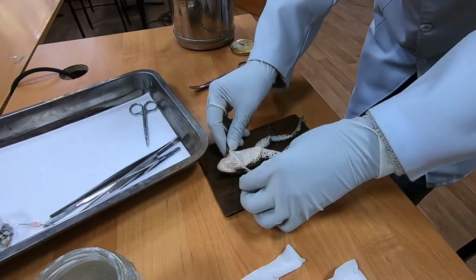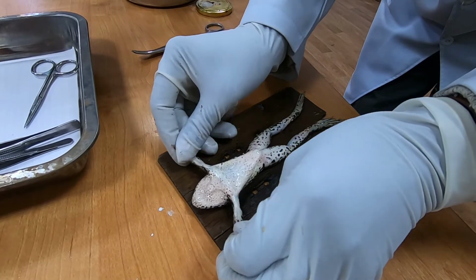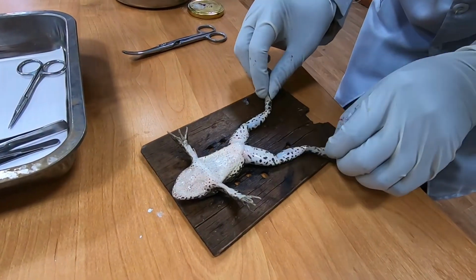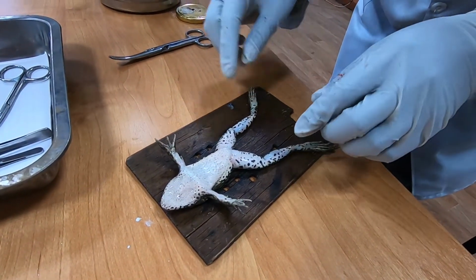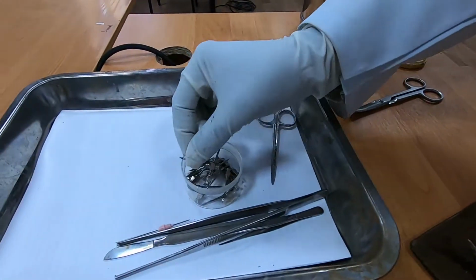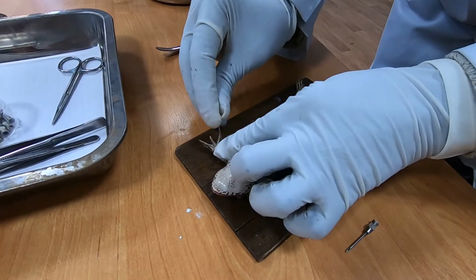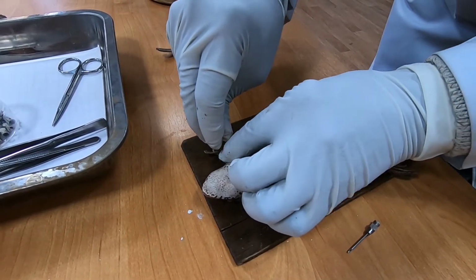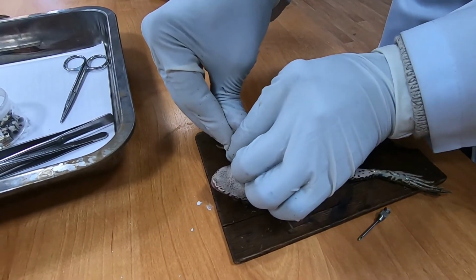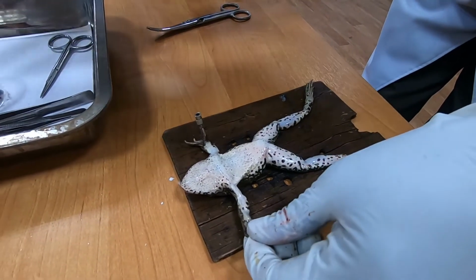Now we have to fix our frog. It's already immobilized. We have our small pins here. We just fix it to avoid any accidental movement in case.